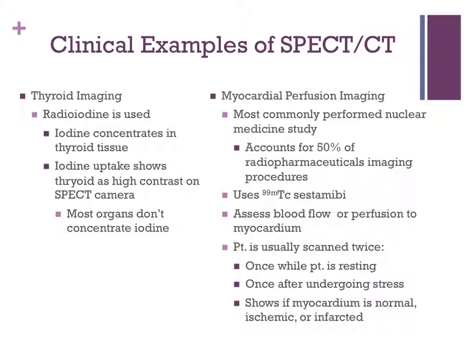Myocardial perfusion imaging uses Tc-sestamibi, and this type of study is actually the most commonly performed nuke med study, and it accounts for about 50% of radiopharmaceutical imaging procedures. These studies assess the blood flow or perfusion to the myocardium in the heart. These studies are often performed twice, once with the patient being administered Tc-sestamibi at rest, and again with the patient undergoing stress. This is either done through exercise or the use of vasodilating drugs.